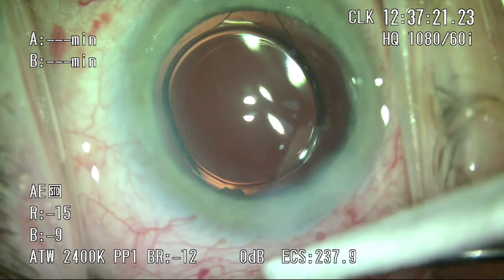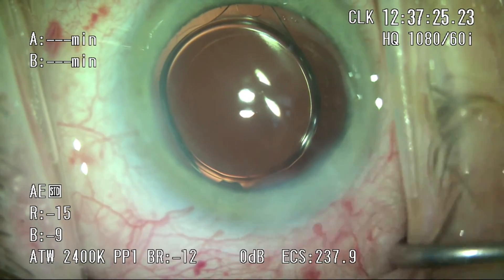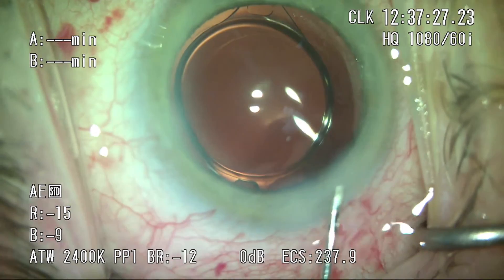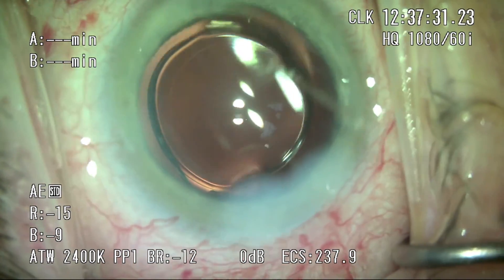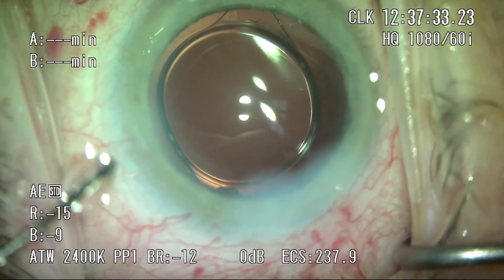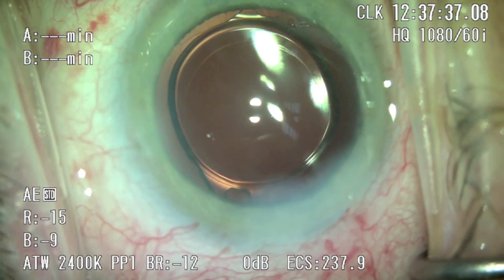Going back to the case, we're just finishing up after removal of the viscoelastic. I'm pushing the lens into a slightly better position as it hasn't quite fully unfolded yet. Once it is, you'll see the lens is well-centered, the rhexis is perfectly round, and perfectly centered on the eye. I hope to share more about our experiences with femtosecond technology and the pearls we've learned. I hope you enjoyed this video, and thank you.